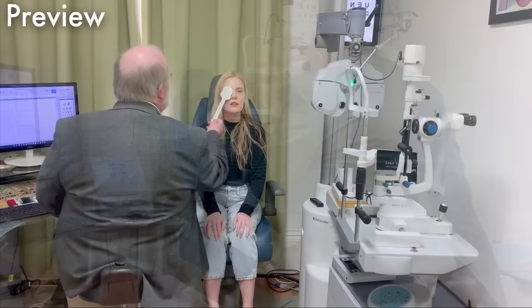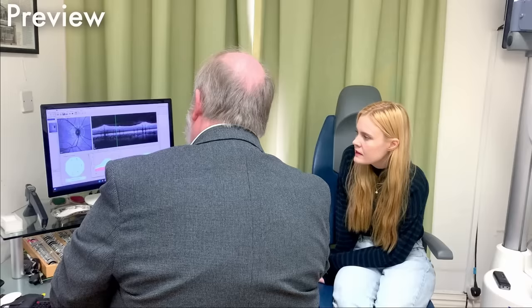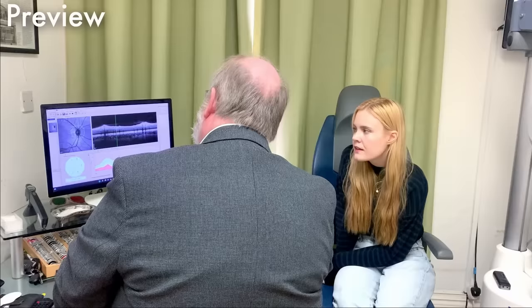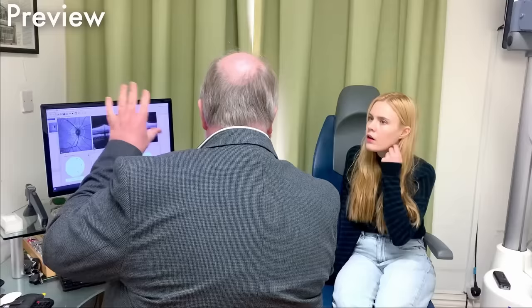Can you manage down to for me? U R on the top. Mm-hmm. U E N. Mm-hmm. Then U E N. So this is the optic nerve. The optic nerve is what takes all the information off to the brain and turn into an image for us. It's also known as the blind spot. Okay. Because it's just neural tissue, there's no photoreceptors there at all. So thankfully we don't see this big area of nothing in our vision, because our brain fills it in nicely for us. You can look at the E just at the beginning of the top line.